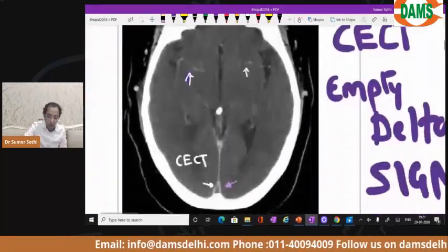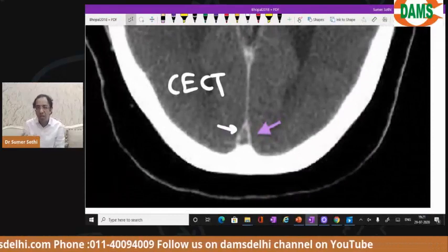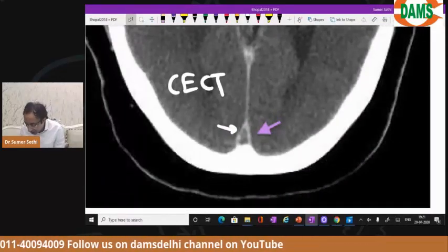Look, I will show you, children, look. This is how it looks like. It will look like a filling defect. The term is filling defect. So we say empty delta sign.